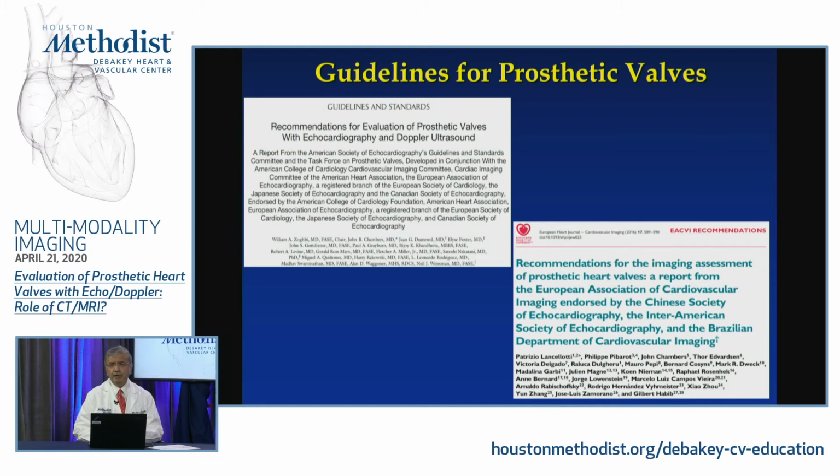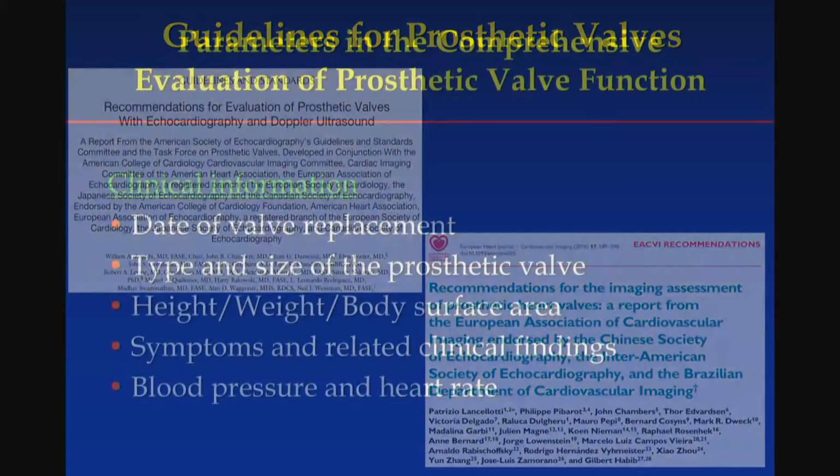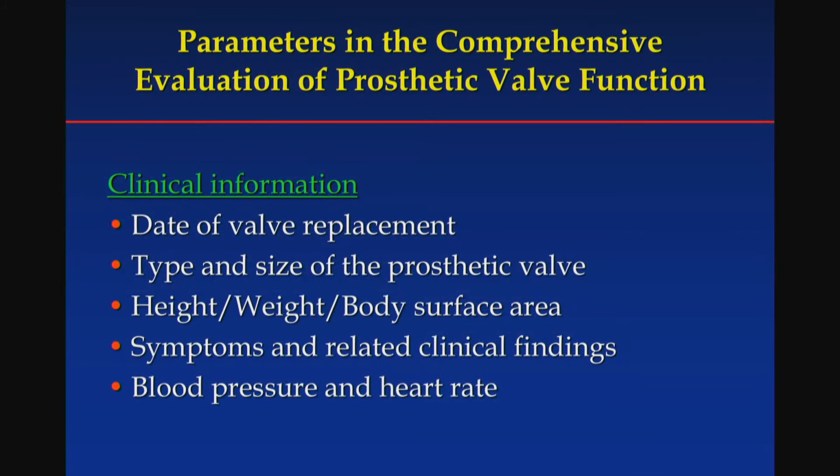They have not been updated because there is really no urgency for the update. The only thing that we will talk about later is the new guideline regarding percutaneous valve procedures, particularly the repair procedures, TAVRs, and the like. So this is for your reference. I think that's important for you to keep in mind.